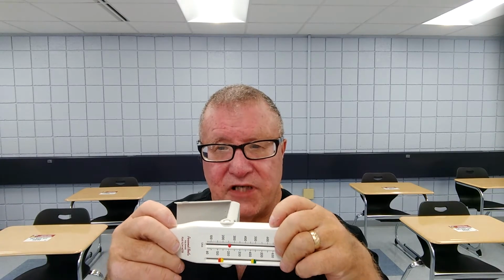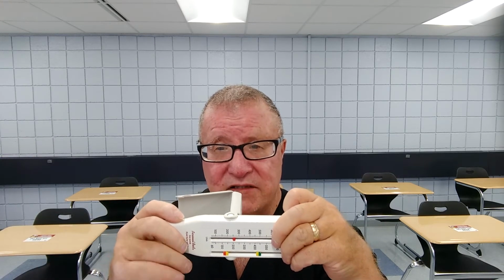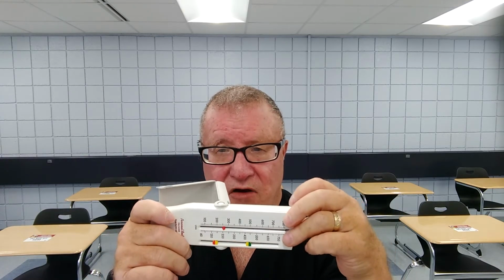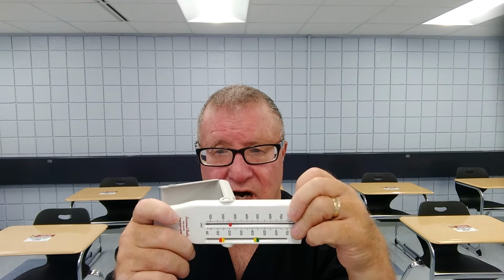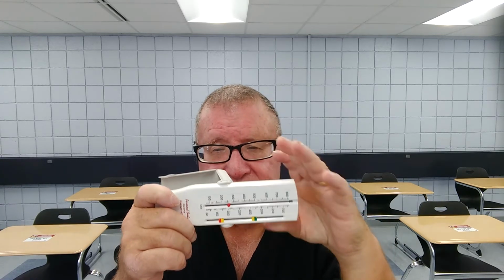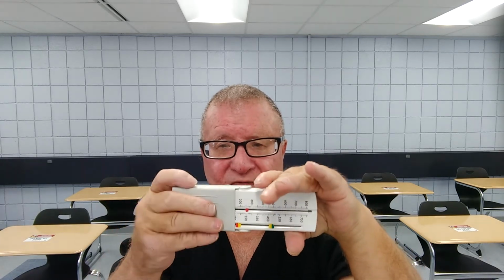Now, again, the green zones and your yellow zones, you're going to set, again, your green zones, it's 80% above what your predicted is. Your yellow zone is from 50 to 80%. Below 50% is a red zone. Red means danger. That means you're having a real problem with your asthma that day. Maybe you need to contact the doctor. You need more medicines than you have at home. Again, this is for monitoring, mainly for the patient in the home environment.